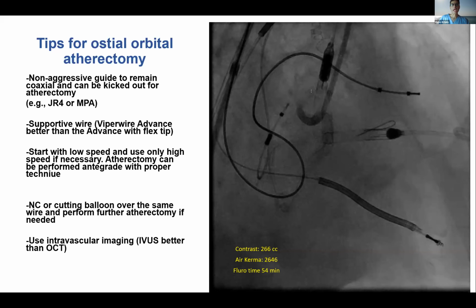and what can be done. And usually always start with the simpler things. Again, the small balloons, the microcatheters, guide extensions first, before going to the more complex and potentially more risky techniques. I personally actually did have a case that I did like 15 runs of orbital and then eventually broke the crown, and then did the rotational, didn't work either.